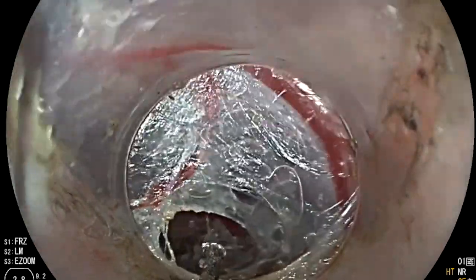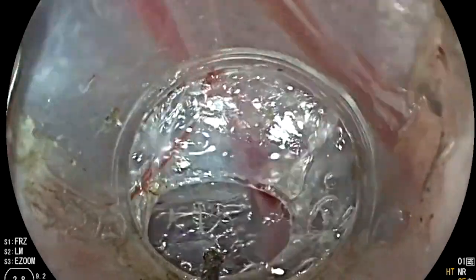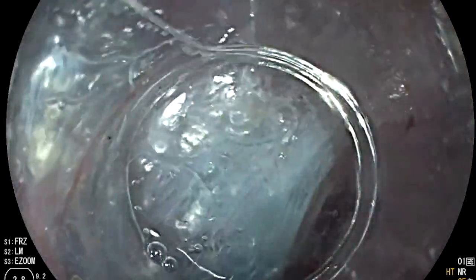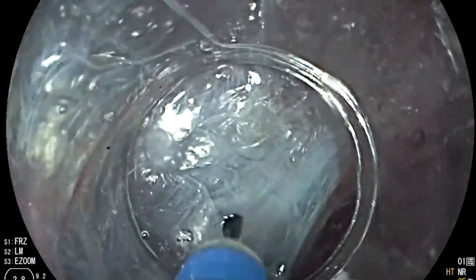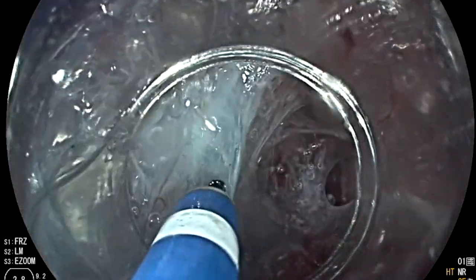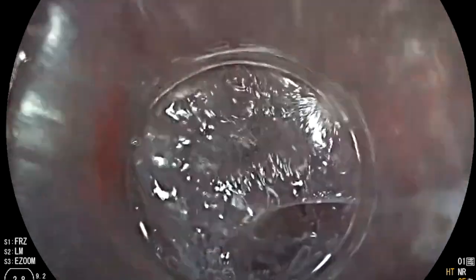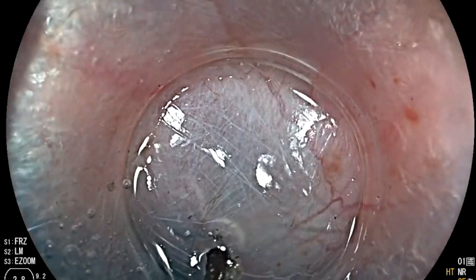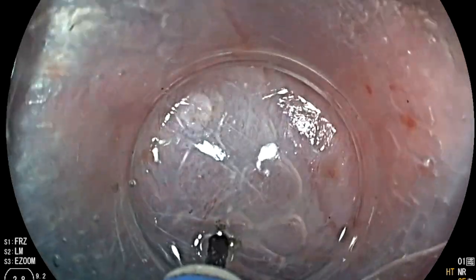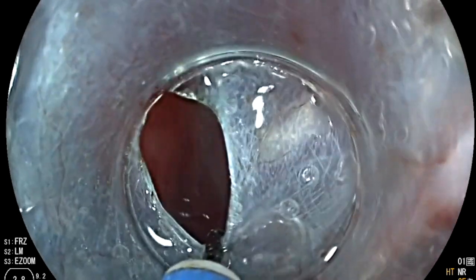We use methylene blue to assist with identification of the avascular planes. Next, we break into the lower mediastinum, which is largely free of areolar tissue, and navigate downwards towards the diaphragm.